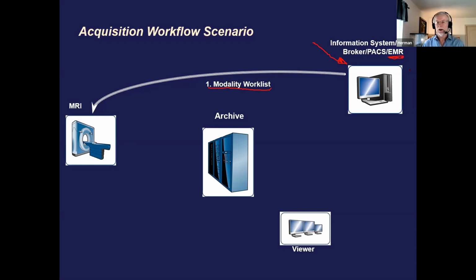But if you still have one of these architectures where we have a separate broker, a separate worklist provider, a separate processor, separate computer, separate server, or run that application on a different server, then typically the server will be depending on an HL7 order coming in. And here's the tricky part, right?